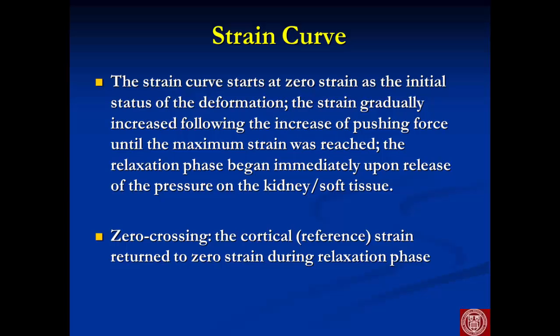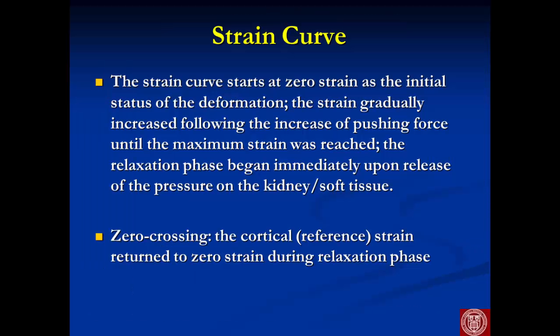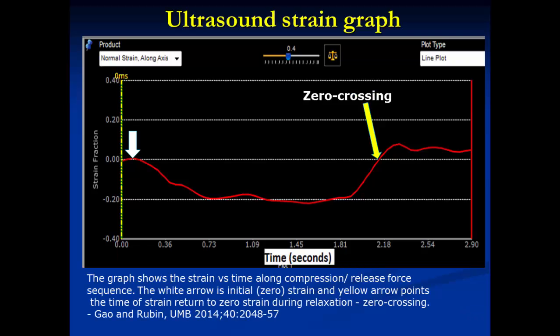Strain curve. This is a strain curve. It starts at the zero strain. Some people call this the preloading condition. And the strain is increased following the push force until it reaches the maximum strain.